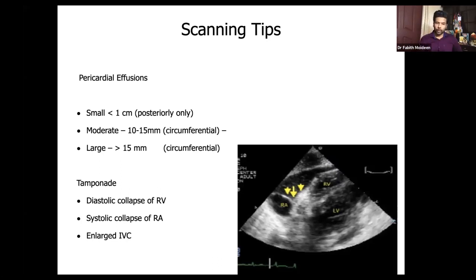Okay. And another important thing you have to understand is there may be patients with CKD who come to you, and they may have a lot of fluid around the heart. Looking at them, you will think, oh, you need to tap this patient. But sometimes you may think, oh, this may not need it. It's a chronic thing, and you don't have to do a pericardiocentesis in this patient right now. We can observe. That is one aspect people do sometimes in a chronic process.